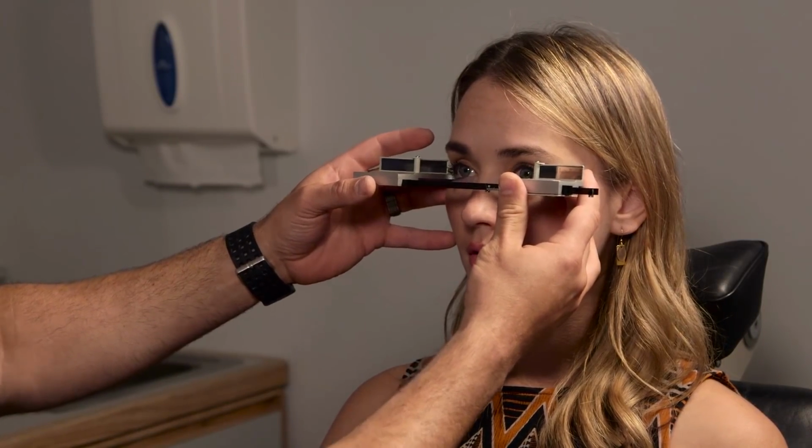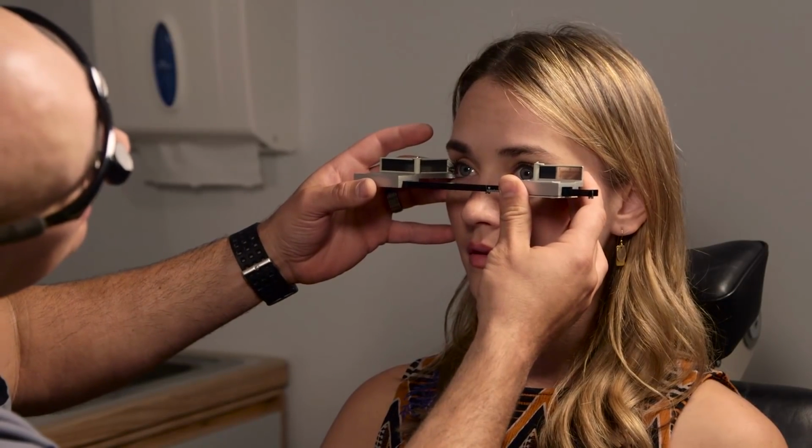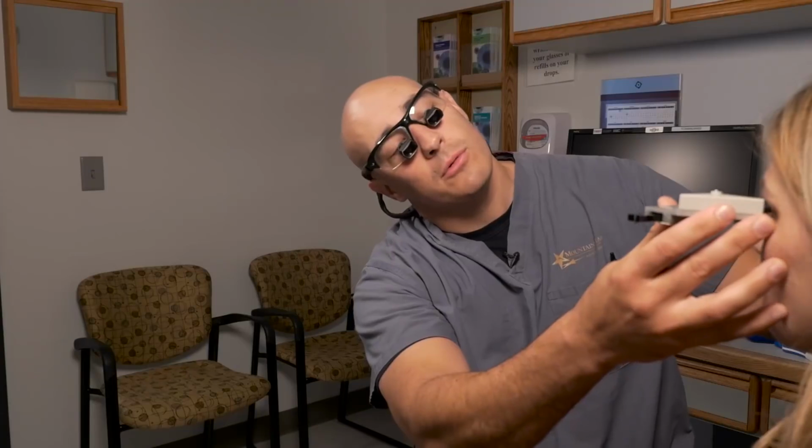That's your 18 millimeter mark. And then you're looking at where the cornea sits on the scale that you see in the prism. And as long as your red marks are aligned, you're square. Okay, so the red line doesn't mean anything except that that's where they happen to place it at 18 millimeters, and you're worried about where the pupil is then sitting on that millimeter scale. If you have them available, I like to use loupes because I feel I can get half millimeter increment readings from the exophthalmometer when I'm wearing my loupes.